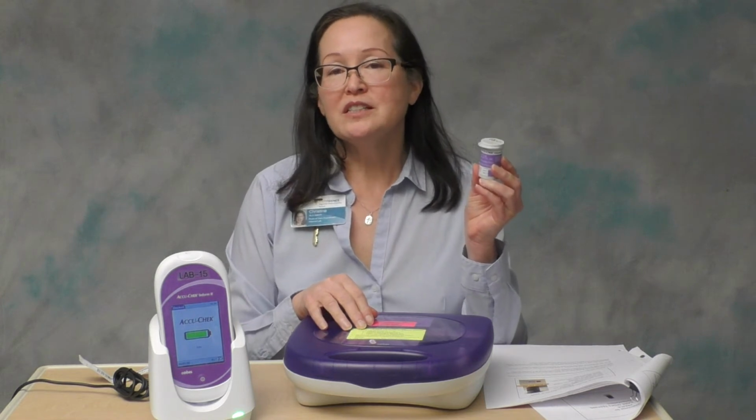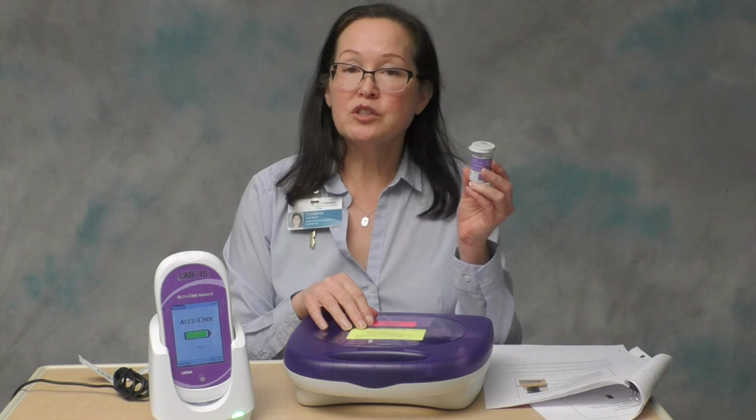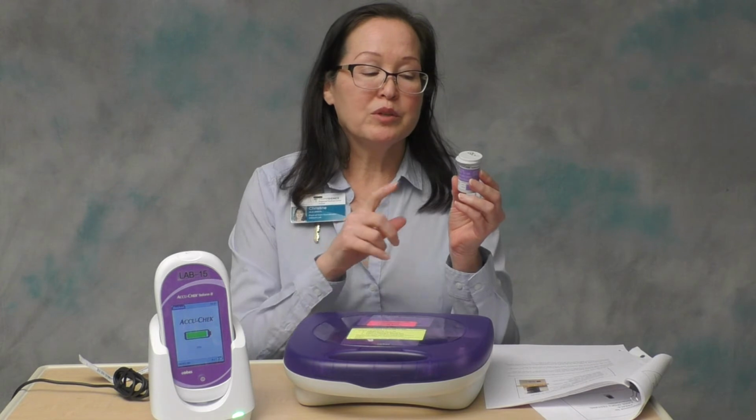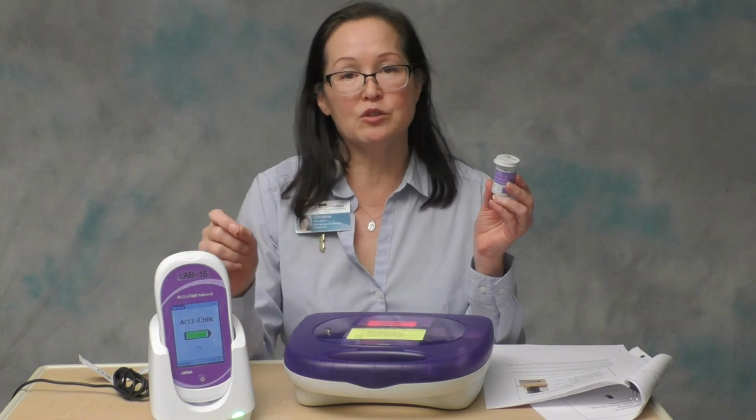The reagent is sensitive to light and humidity, so the chemical will start to degrade once the strip is removed from the vial. For that reason, you need to leave the strip in the vial until you're prompted by the meter to insert the strip.